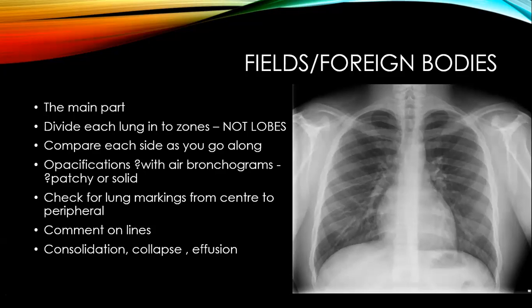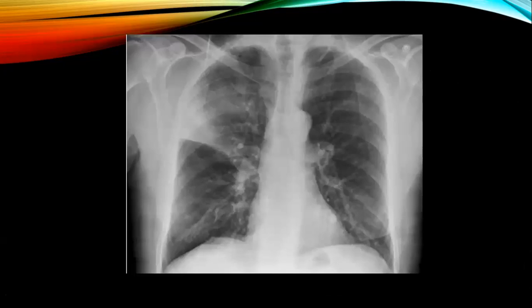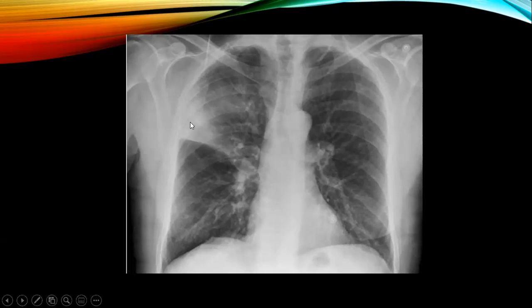This is an X-ray for a patient who has pneumonia. In the middle zone there is an area of denser opacification, and you can see the horizontal fissure very well — you can only see the horizontal fissure clearly if there's fluid in it, which shouldn't normally be there. There's fluid in the horizontal fissure, denser opacification, and then patchy opacification surrounding that. This is a consolidation. A lot of people say a consolidation is anything white on an X-ray, but that's not correct — opacifications can be patchy in nature and are often associated with an air bronchogram, which I'll show you shortly.